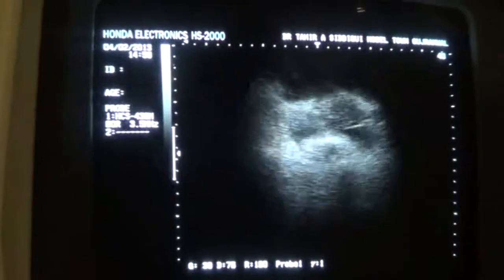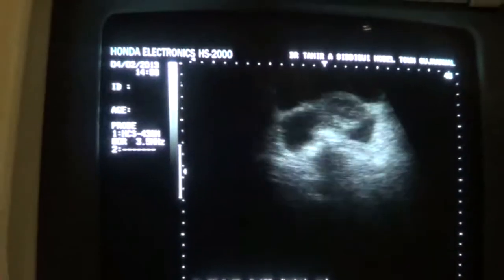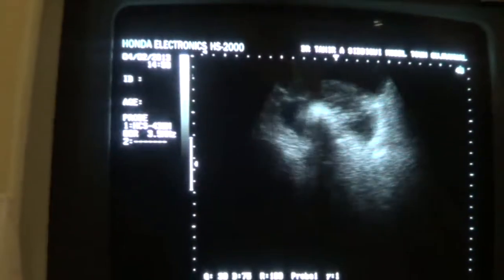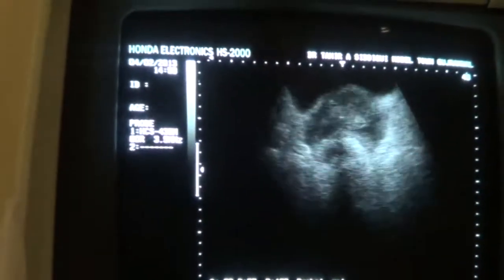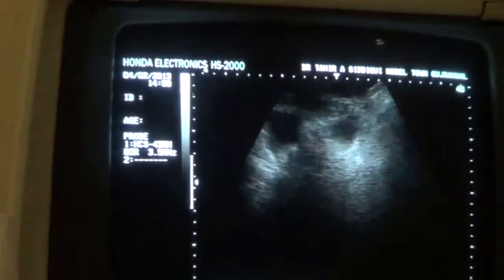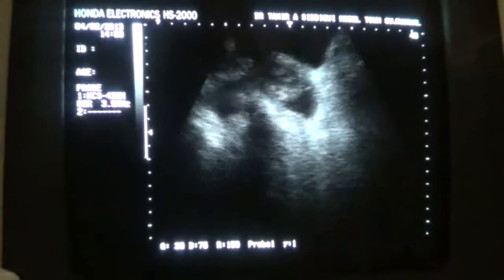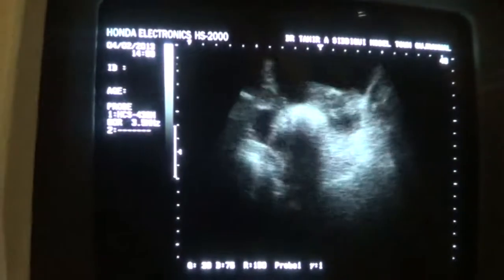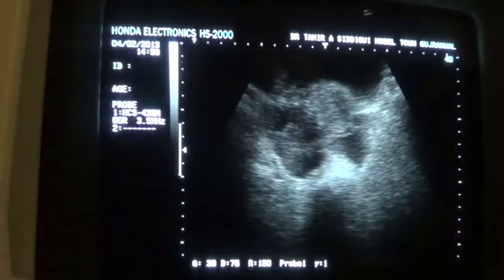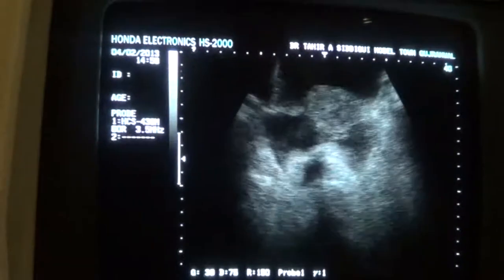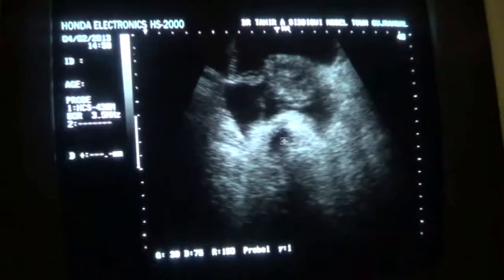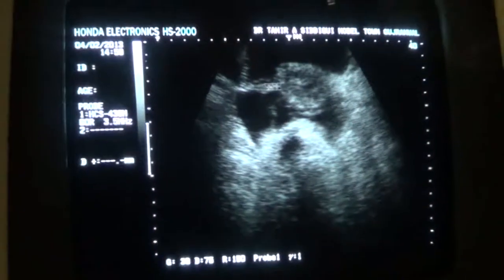You can see the broad ligaments through this patient, with ascitic fluid dependent between them as well. This is the right broad ligament.